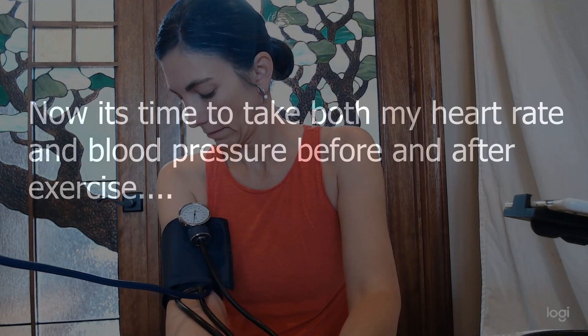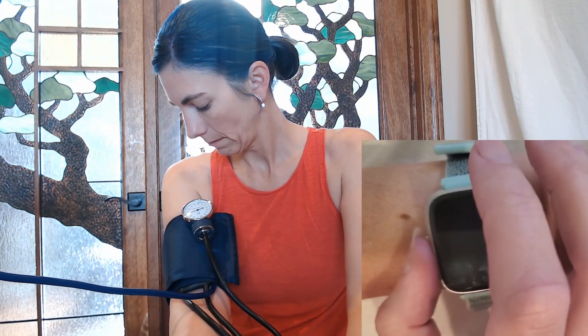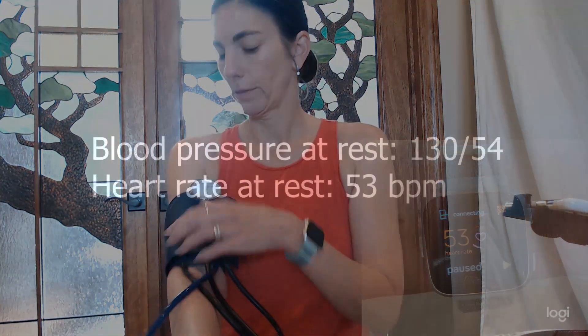So now that I've demonstrated the pressure cuff for you, I'm going to actually collect the real data that we need for this lab. So here we go.